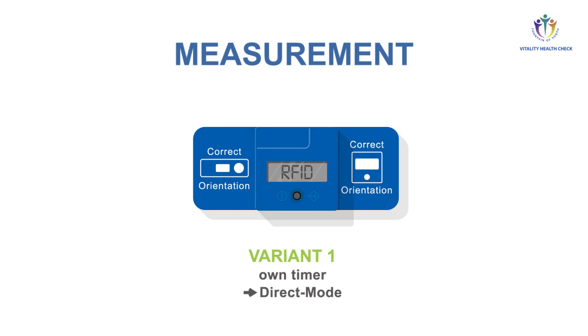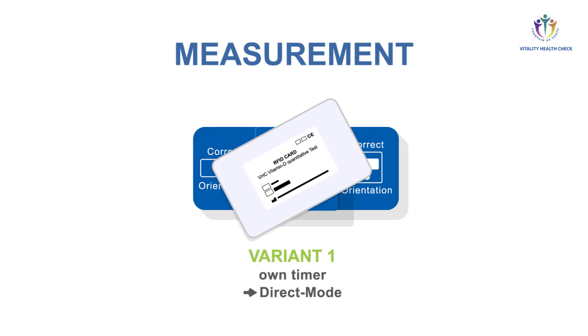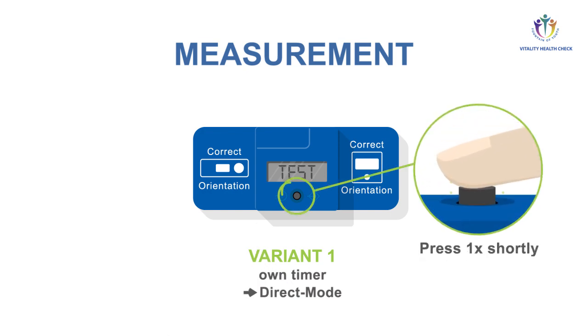Make sure the lot numbers of RFID card and test cassette are matching. Place the RFID card on top of the VHC reader. A beep tone confirms the data transfer was successful. The display shows test. Press the button again shortly.